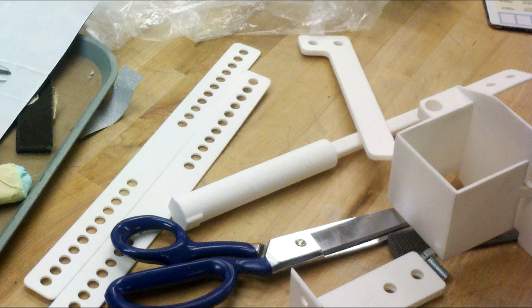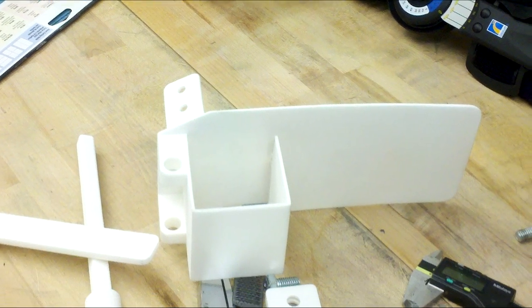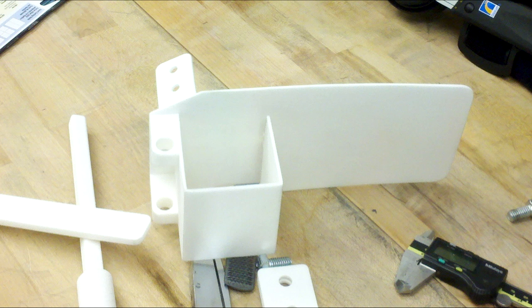The brackets and upper mount were designed to slip into the ends of the knee brace without modification to the knee brace itself. Seen here is the second version of our footrest, which was smaller than our original footrest, but was too small to contain the motor or support the forces which were going to be exerted upon it.